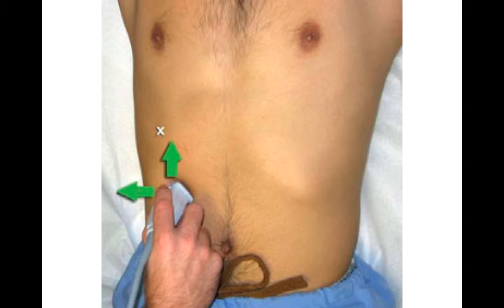Sometimes, if you're still having difficulty, you can put the probe above the costal margin to use the liver as a window and avoid the bowel gas. When looking through the ribs, it is often useful to use the smaller probe with a smaller footprint.